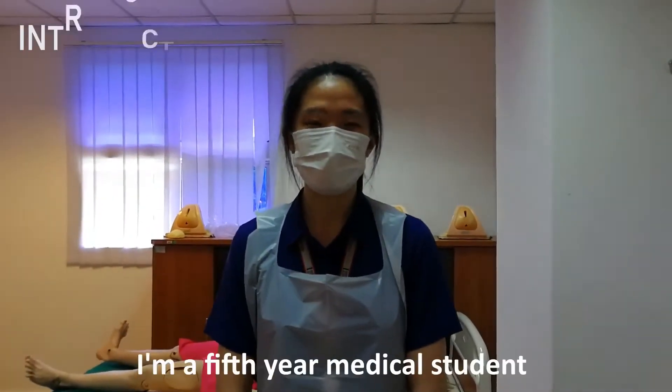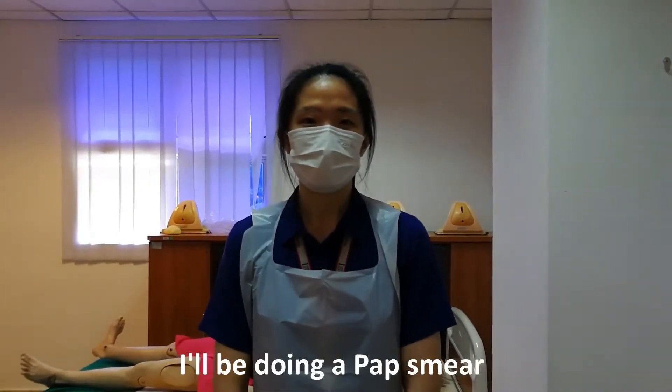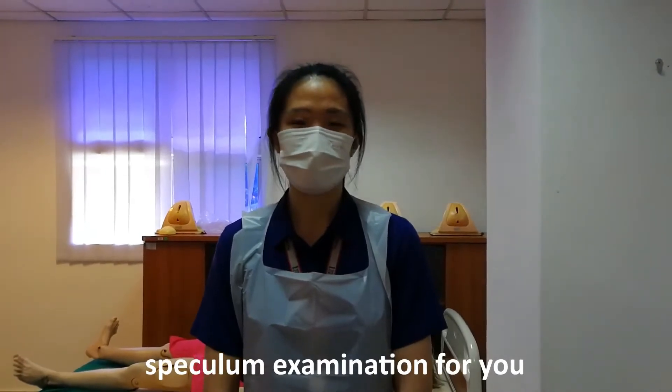Good morning. My name is Charis. I'm a fifth year medical student from UPN. Today, I will be doing a pap smear and also a speculum as a demonstration for you.